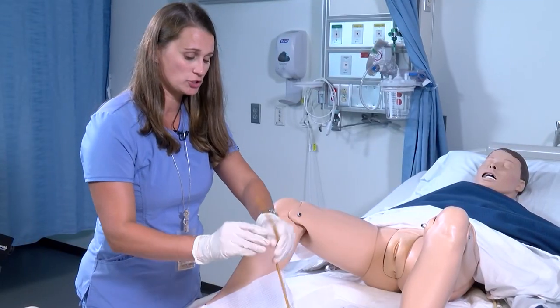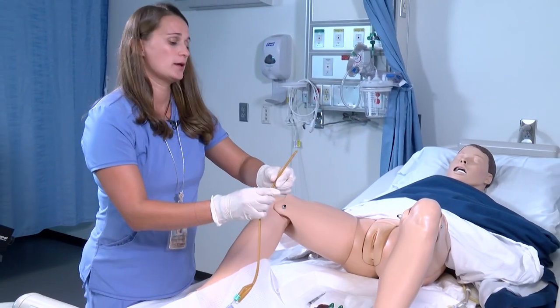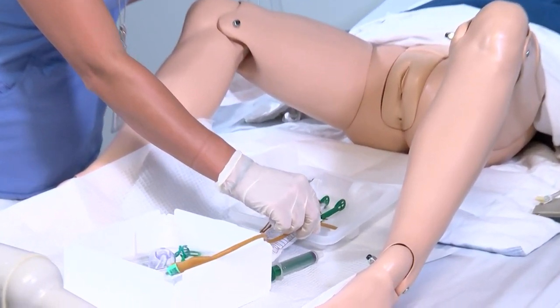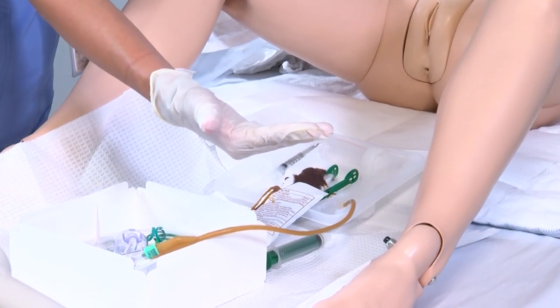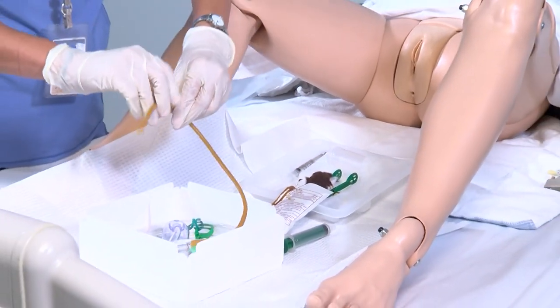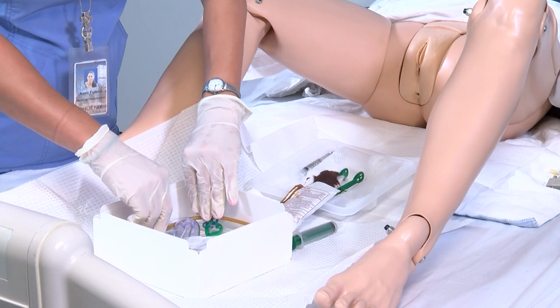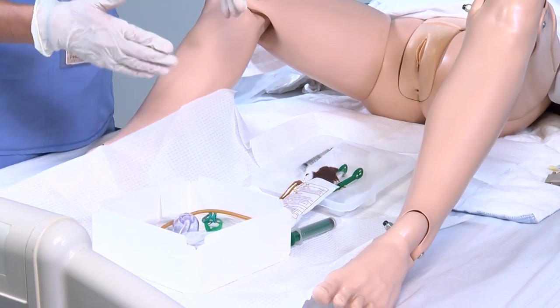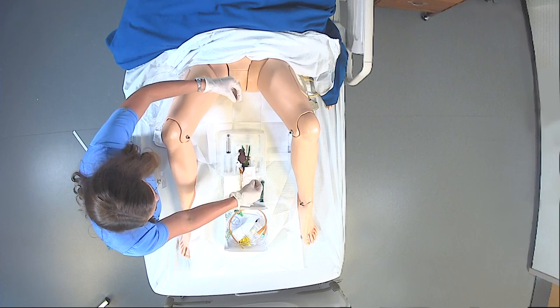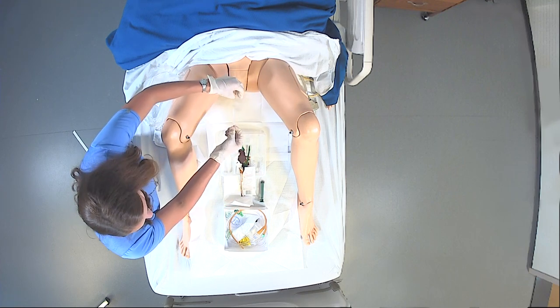Next, I want to show you the catheter. People like to place the catheter in the lube, which can sometimes cause it to flop off the sterile field. So best practice is to leave the catheter placed in the box so it doesn't flop over. When you're ready to place it, you can dip it into the lubricant right before you insert it into the patient.